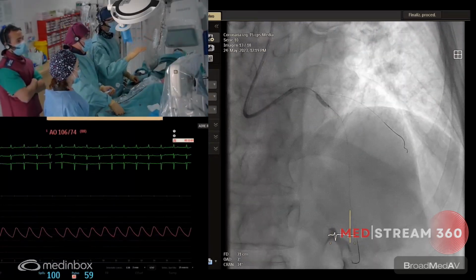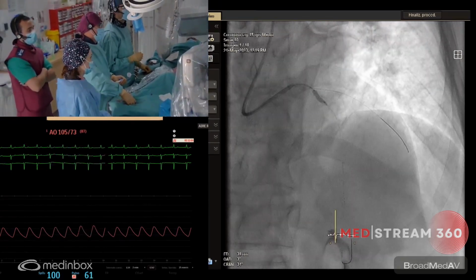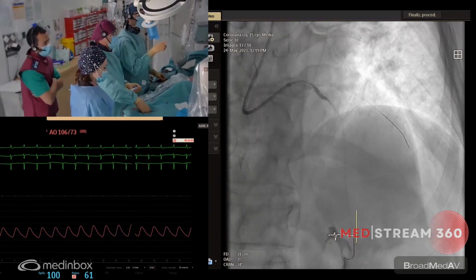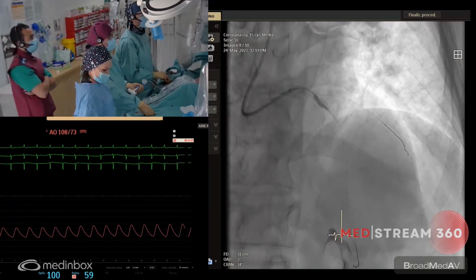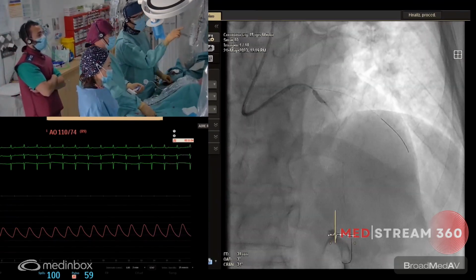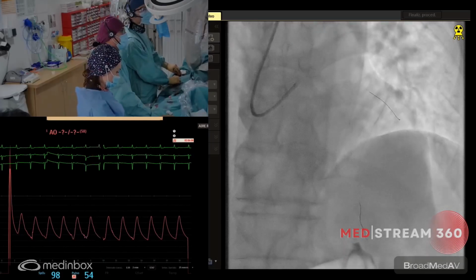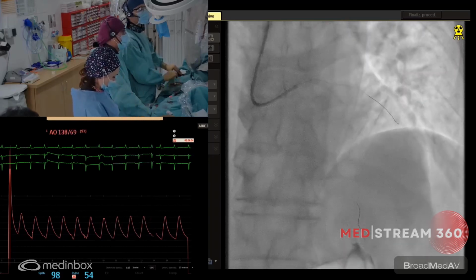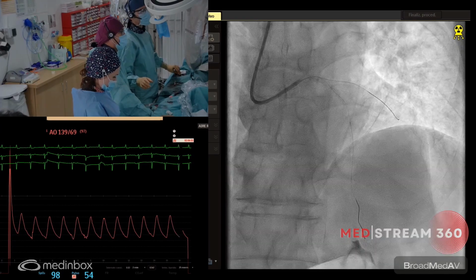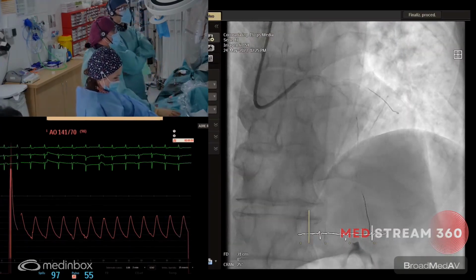captured by the left ventricle, and sometimes you see some slight decreasing of the blood pressure, but always well tolerated, or almost always. But here, in this case, because of the limitation of flow, probably the patient has done some extra beats. Now we have to decide what to do: to perform OCT, to post-dilate with a non-compliant balloon, or to treat the diagonal first.